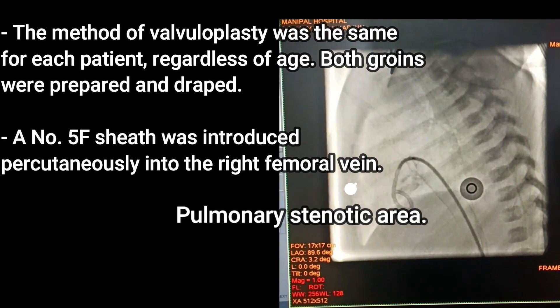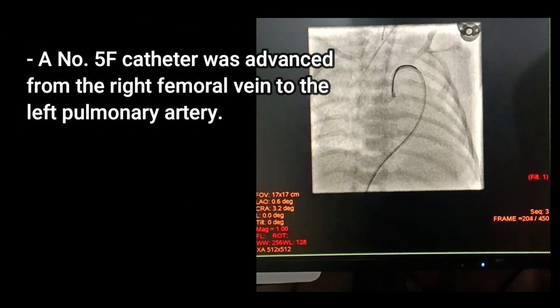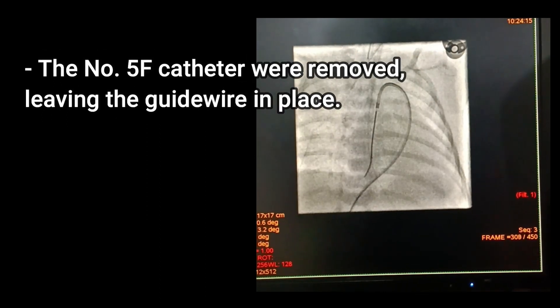The method of valvuloplasty was the same for each patient regardless of age. Both groins were prepared and draped, and a number 5F sheath was introduced percutaneously into the right femoral vein. A number 5F catheter was then advanced from the right femoral vein to the left pulmonary artery.